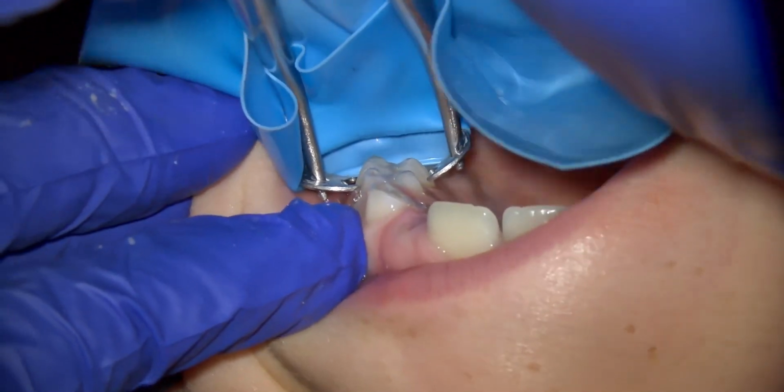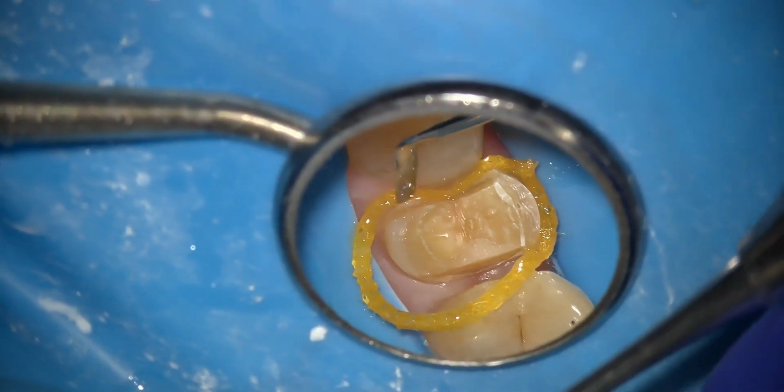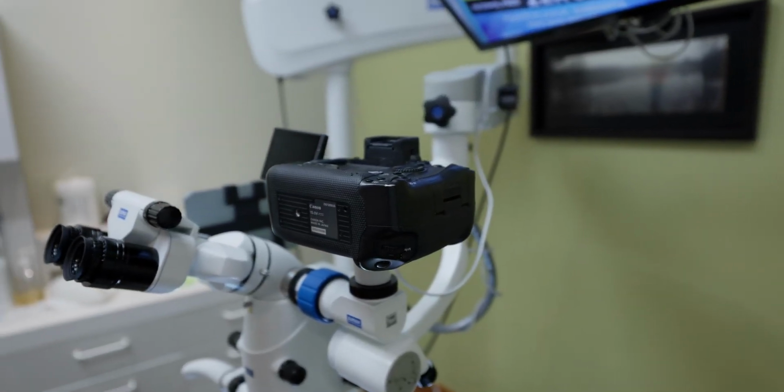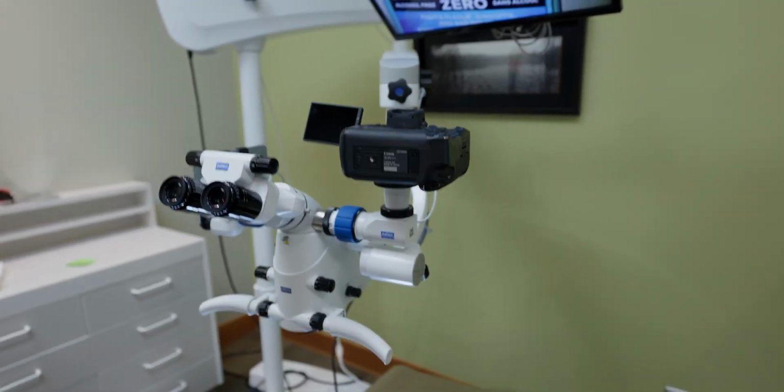Honestly, I have no need for anything better than that. It is incredible. It looks amazing. The only caveat would be if you're shooting in really low light. So for instance, if you turn your curing filter off and you're working with composite, you'll have to dim the light of the microscope down quite low so you don't cure your composite prematurely. If you're doing that, maybe that's when the mirrorless camera here would give you an edge. And you could film in that one situation if you really, really wanted to.